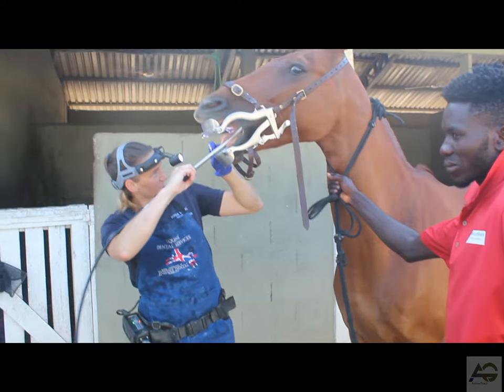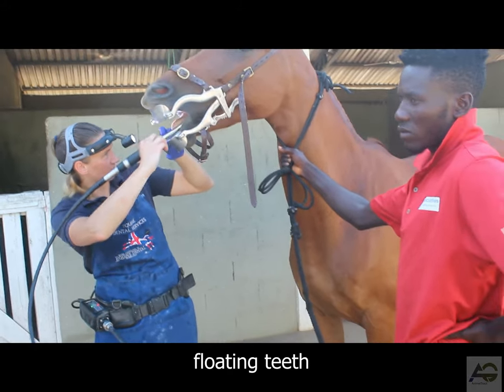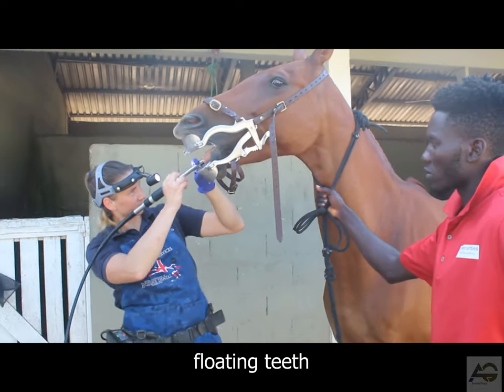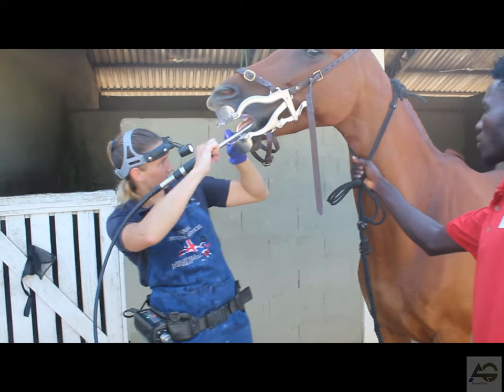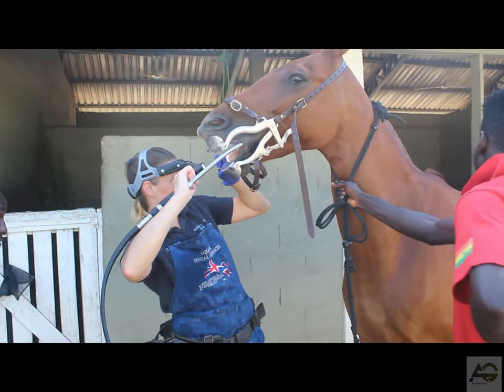Step 5: Floating the teeth. Begin by using the floating tool to gently remove any sharp or jagged edges on the teeth. Be careful not to apply too much pressure, as this can cause pain or injury to the horse. Make sure to float both the upper and lower jaw, paying close attention to any areas that may need it.